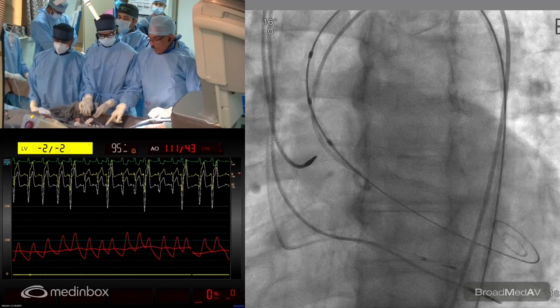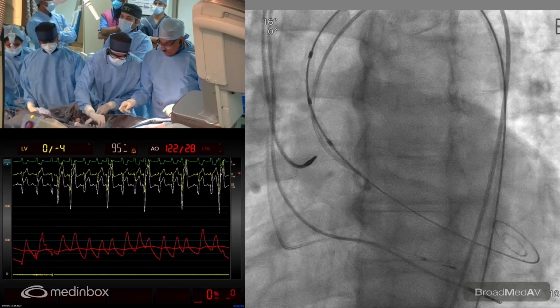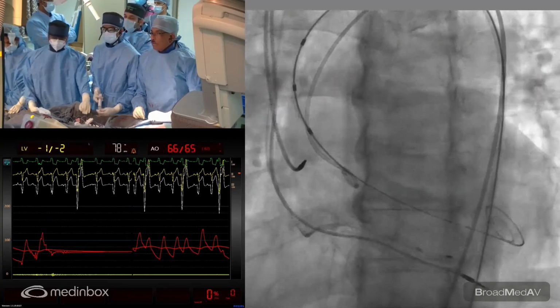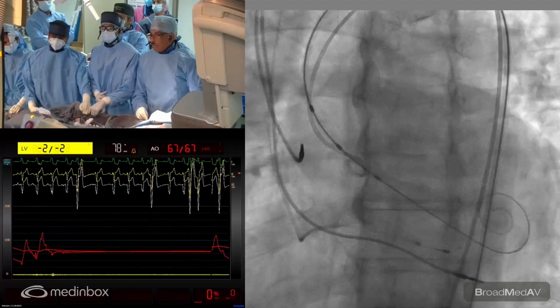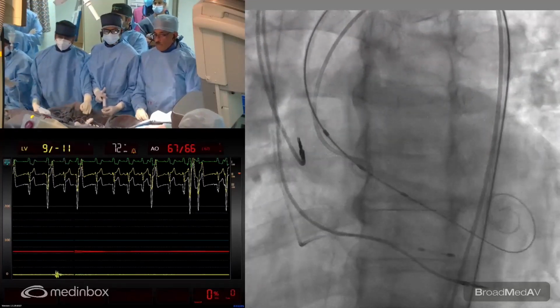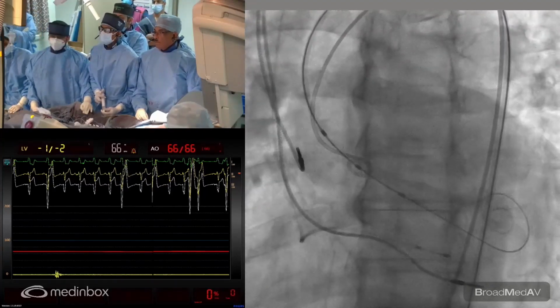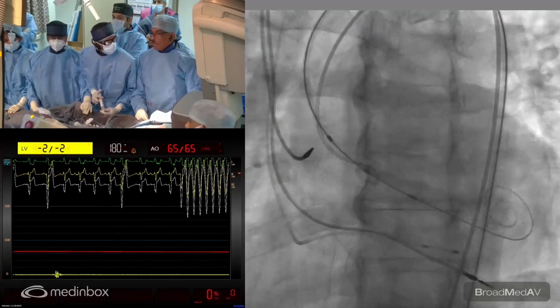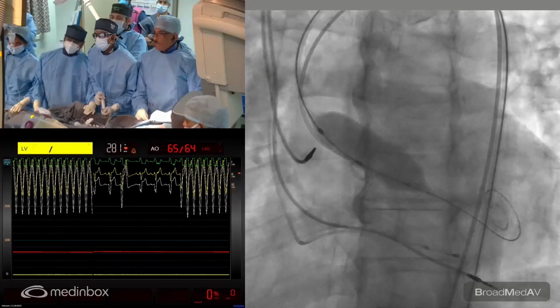Okay, so now we need to inject. So are we ready with the injection? Prabhu? I need a simultaneous pressure injection, please. Okay, pacemaker ready, sir? Are you ready, Ravi, with the pacemaker? Okay. Please go up. Pace, please. Yes, 180, please. Yeah, okay, pressure flat. I'm going up. And inject.